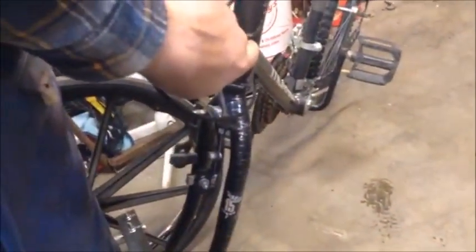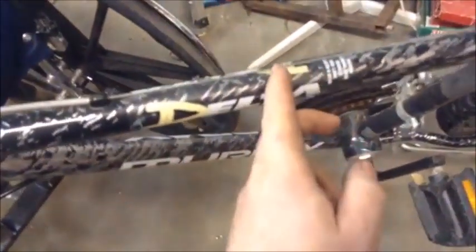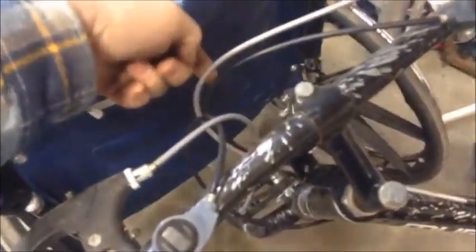Okay, so the front forks are attached down to the bottom of the wheelchair, but you see the headstock angle. See how it's tilted up like that? This is the headstock. The problem here, as we turn a corner, see how the bike's leaned over? That's because of this angle. So what we're going to do here is cut the backbone and notch the down tube. We're going to cut this all the way through here, and we're just going to notch this right here. Then we're going to bend this out so that this headstock is straight up and down. It'll be right up here when we're done.